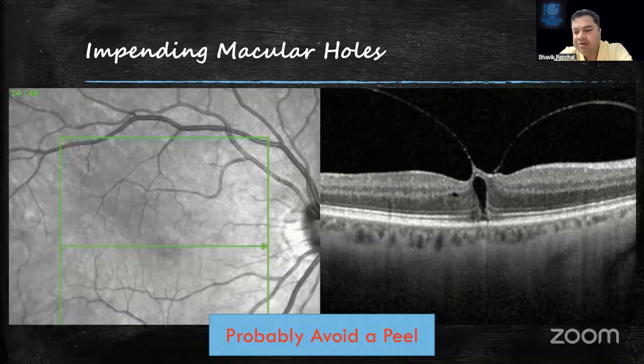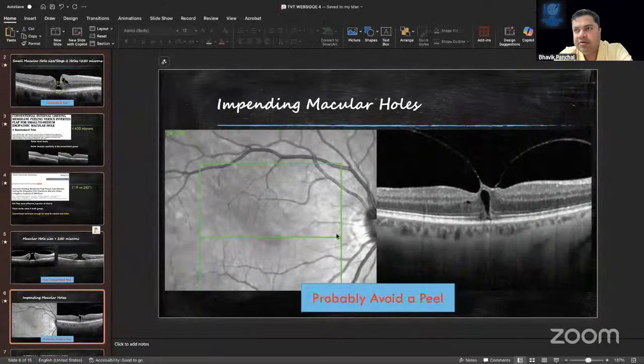So I want to bring in Dr. Mohit here, since you are working in an institute. Dr. Mohit, what are your indications apart from what Shishir mentioned for a conventional ILM peel?